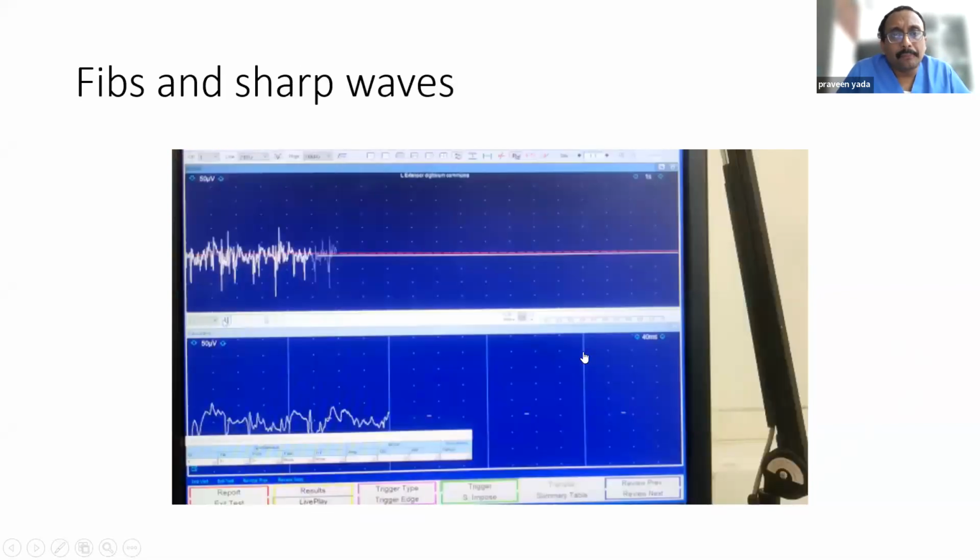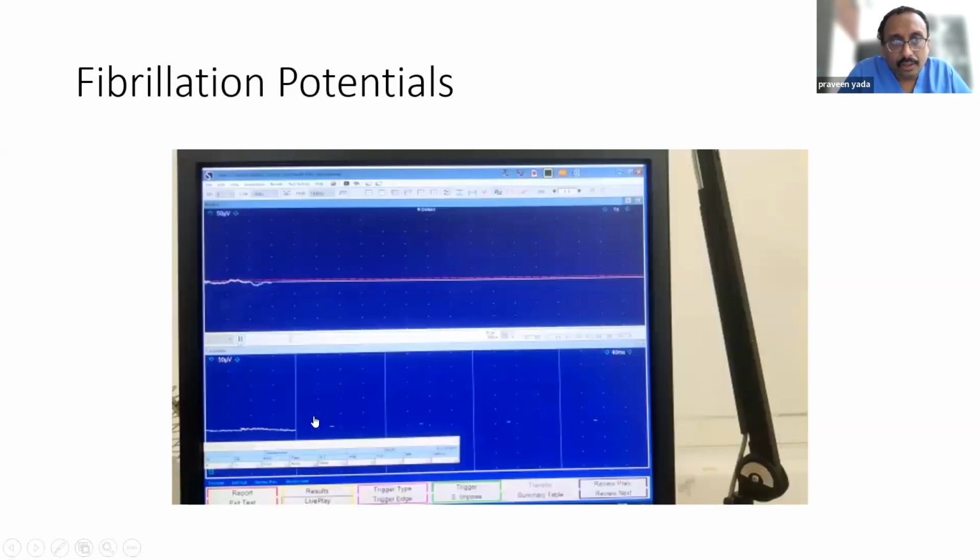Now, the next most important thing we look at is a fib and a sharp wave. Definitely, I'll share it with you. But what you have to appreciate is that this is a video just of the fibrillation.